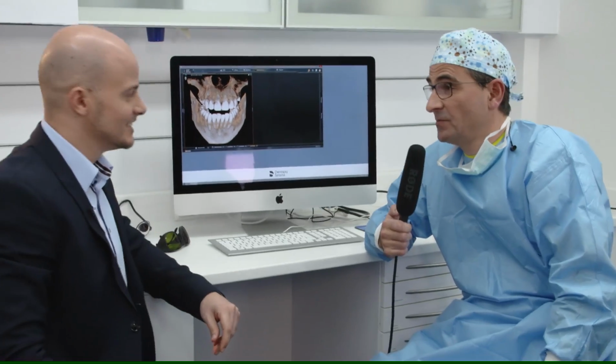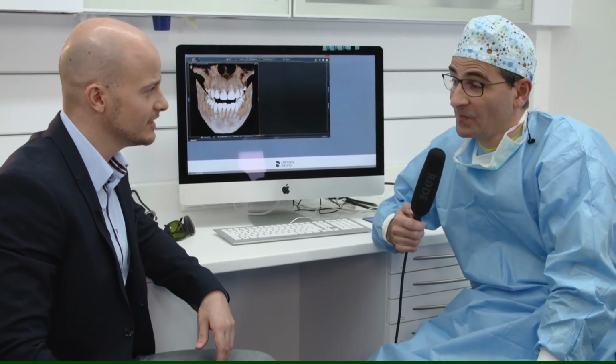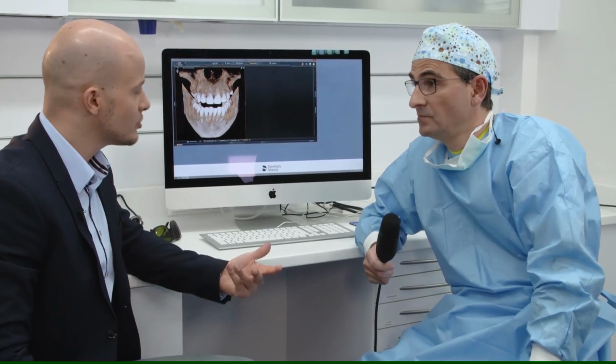Yeah, it was routine, as it is every time you do guided surgery. It was very fast, and the patient also felt very well. So was it an easy surgery for you?